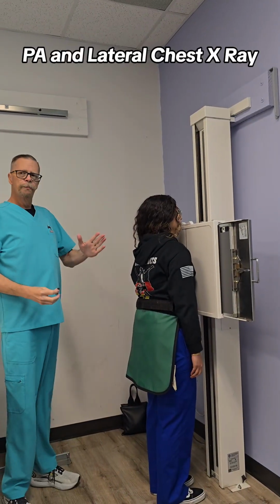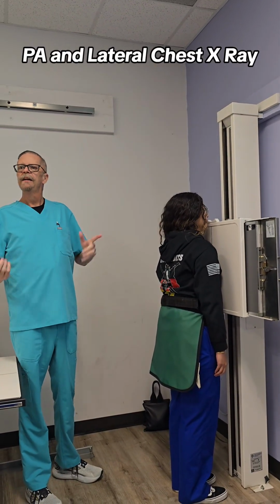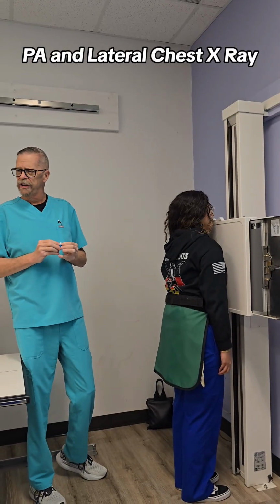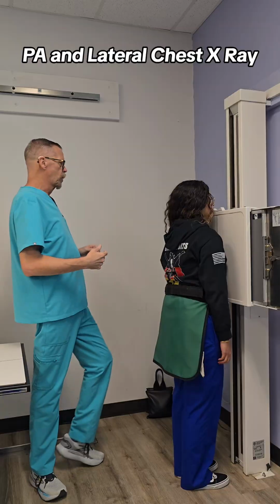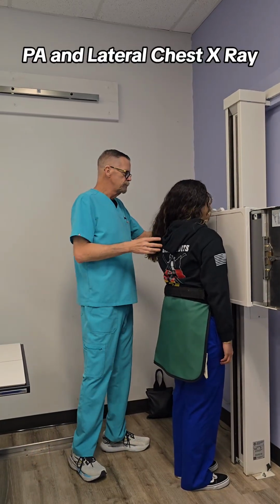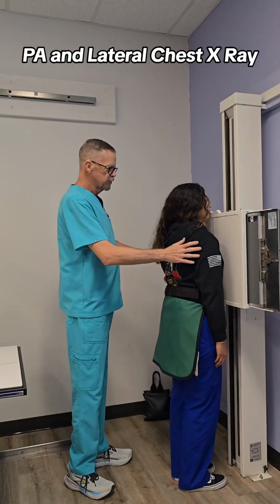The patient's heart is on which side, left or right? Left. So we're going to use a left marker for these, just because we're going to do a left lateral as well, so that way you don't have to change your marker. Let me move your hair so I don't tape it. So, left marker, stand all the way here.